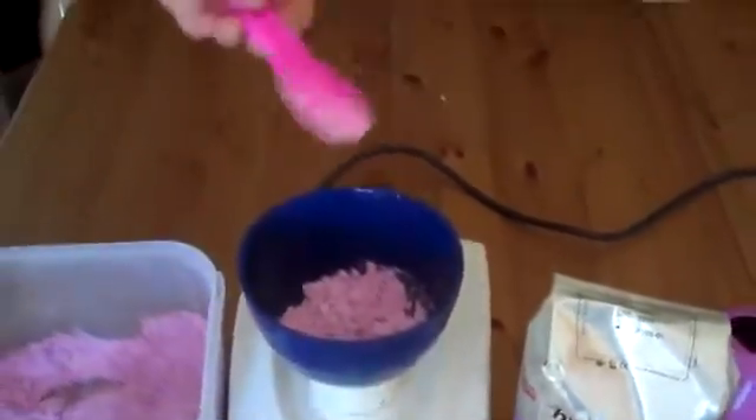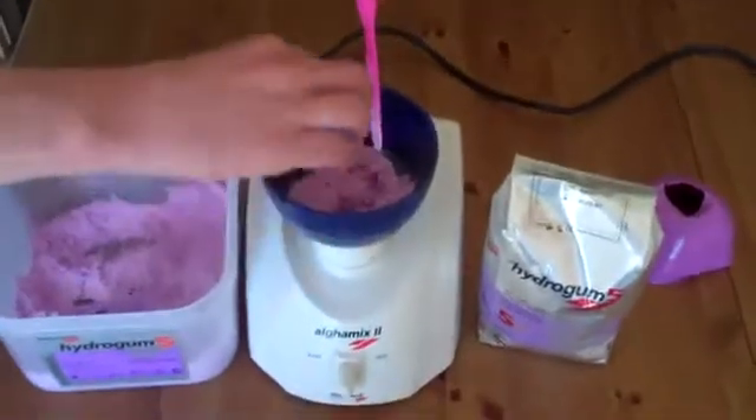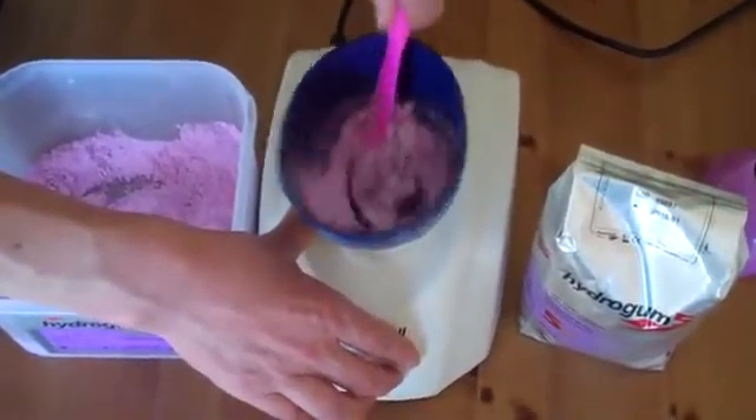And like I said, a 2-speed motor. The powder's in there already, so we drop the water in. On the slow speed, I'm just rocking the spatula to wet the alginate.